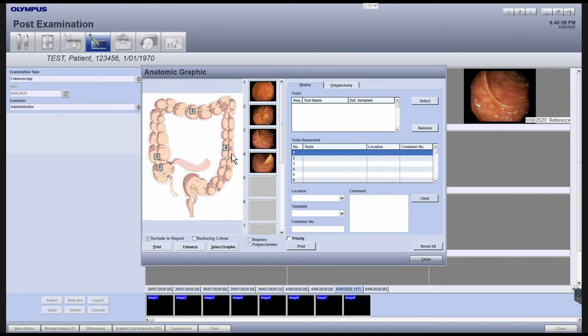To remove a number marker, drag the marker outside of the Anatomical Graphic pane. To include the graphic, make sure that the Include in Report checkbox is ticked.